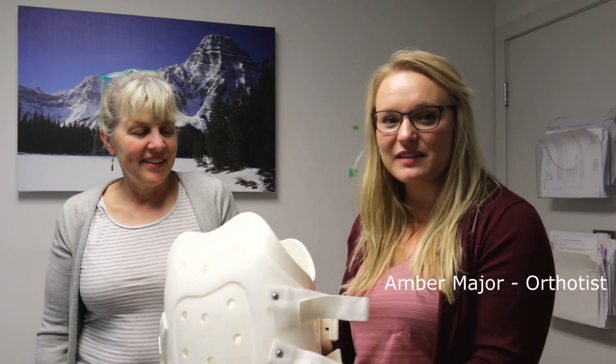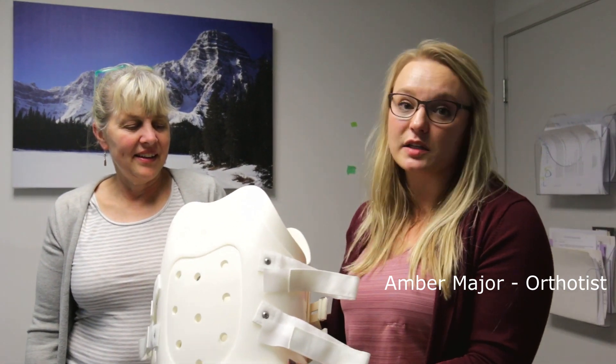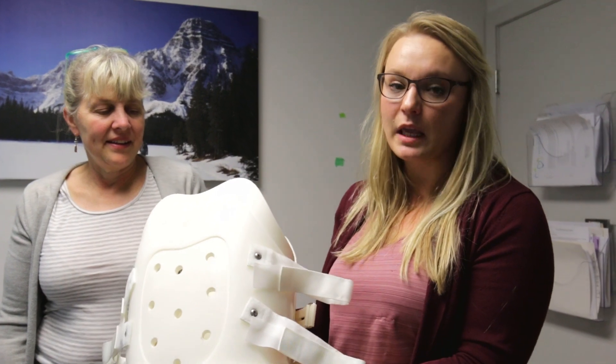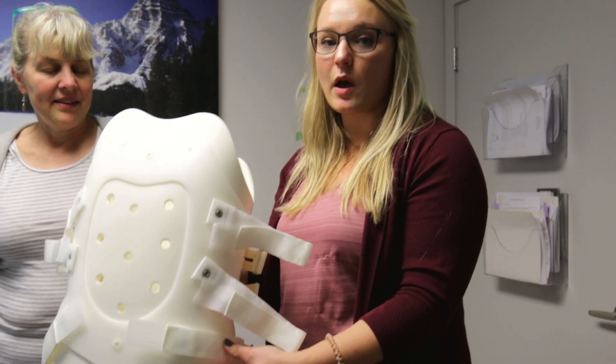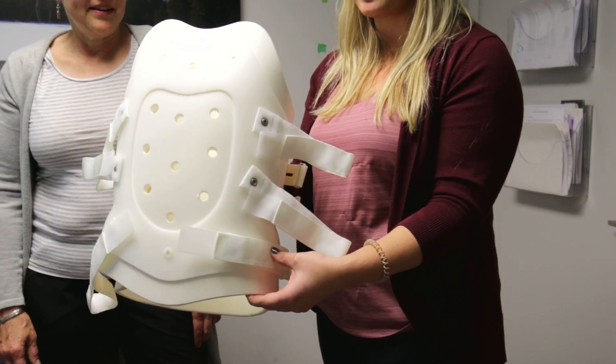Hodgson Orthopaedic Group has developed this video for your reference upon discharge from the hospital as a patient. Today we'll be fitting a clamshell or a TLSO for a spinal fracture.